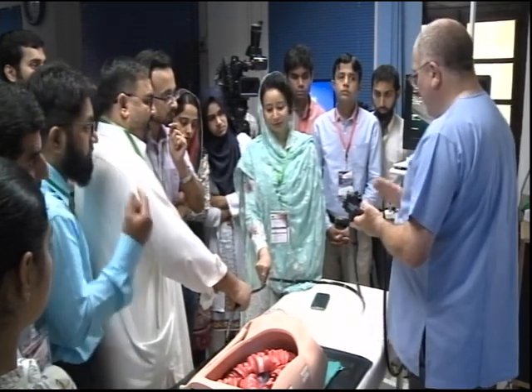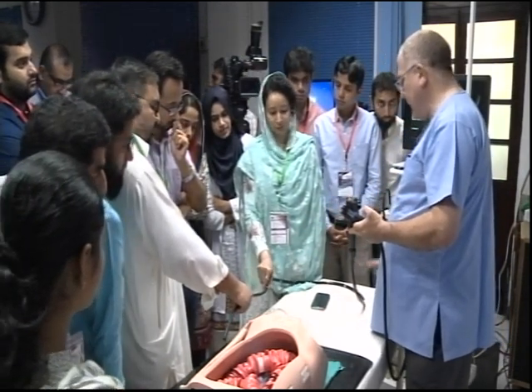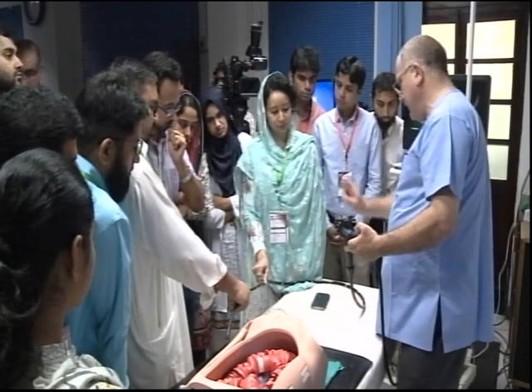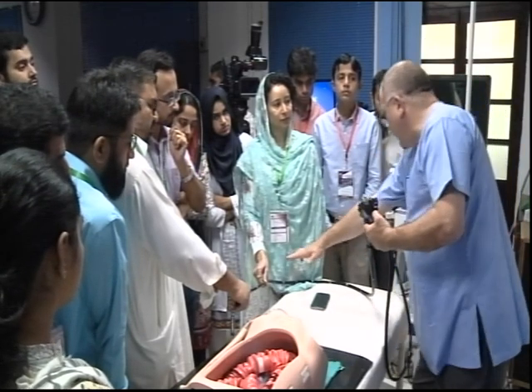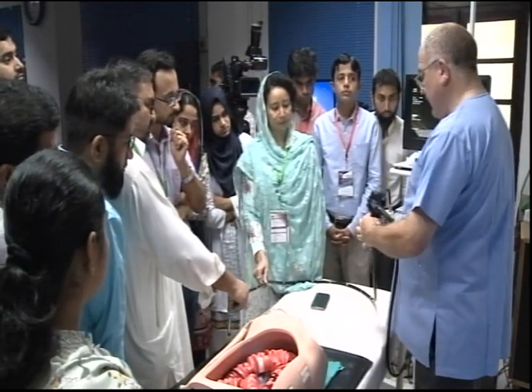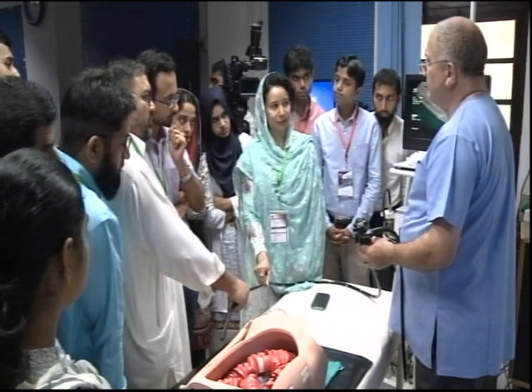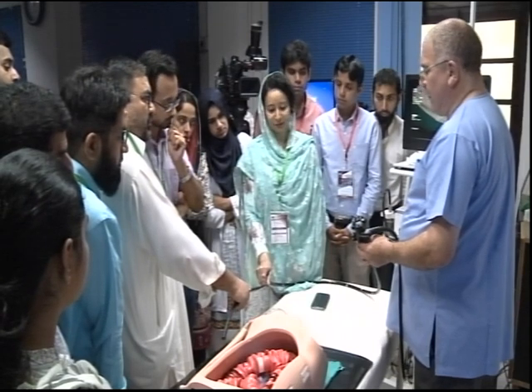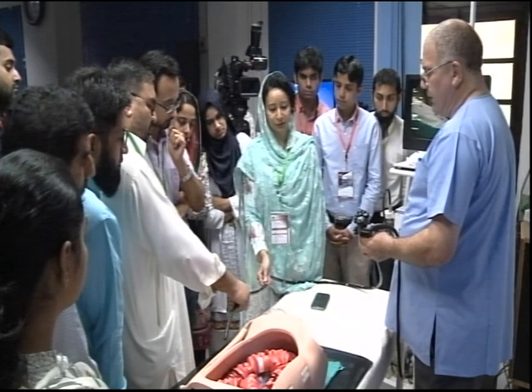Okay. So what's happening is you force it. Keep the torque on. Keep it on. You're letting it go. And keep it straight. Keep the torque on and keep it straight. So it feels stiff. So what you're forcing in is all this into the bed. If you do this to the scope, how does it feel now? Getting stiff. Put your torque on as much as you can, whichever direction you want to go.